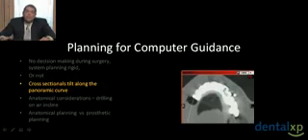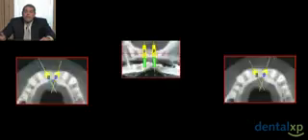So when we're in the posterior areas of both the mandible and maxilla, we can draw those lines relatively straight, and we can have cross-sectional images that are parallel to each other, and when we rotate our implants, they're going to rotate within the same plane and path. When we come around the anterior mandible and maxilla, just by nature of the curve of that arch, what we're going to find is we can't do that.